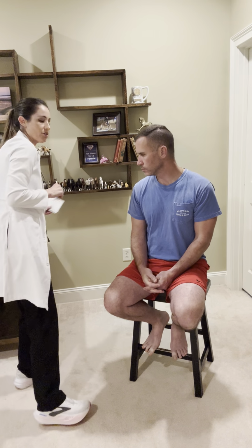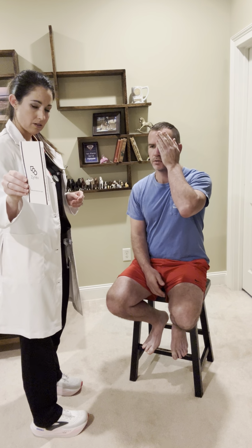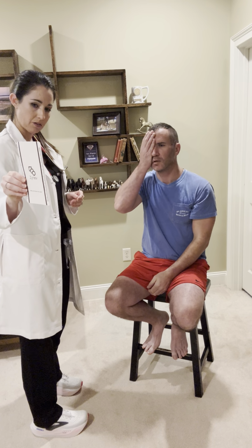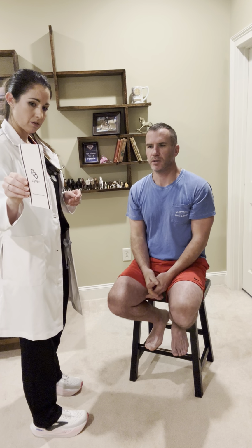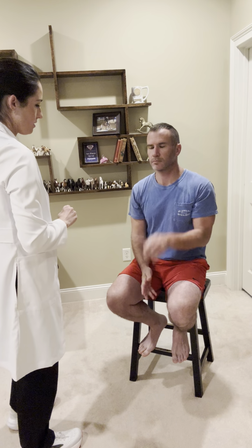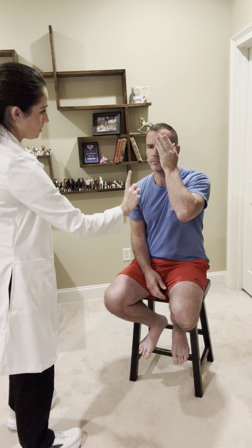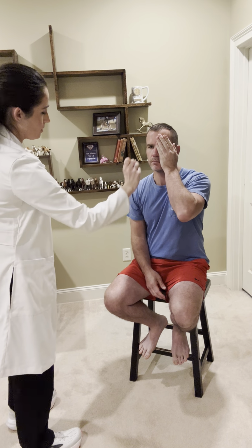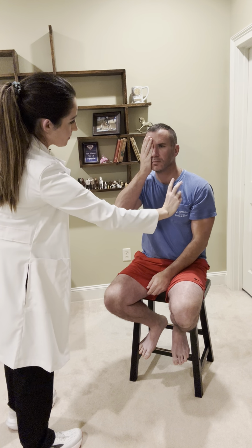So get our Snellen chart for visual acuity. Cover your left eye, read the lowest line. LTFPH. Okay, right eye, read lowest line again. LTFPH. And both. LTFPH. Okay, for central and peripheral vision, cover your left eye. Tell me what number. 1, 2, 1, 2. Other eye. 1, 2, 1, 2.